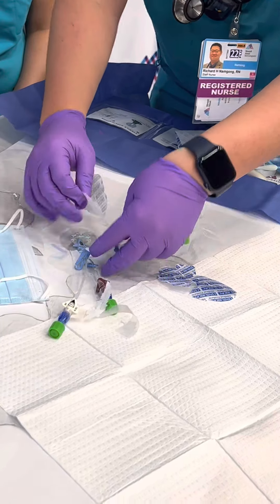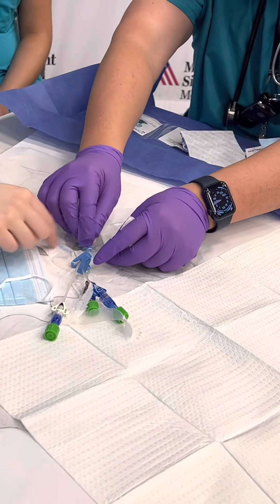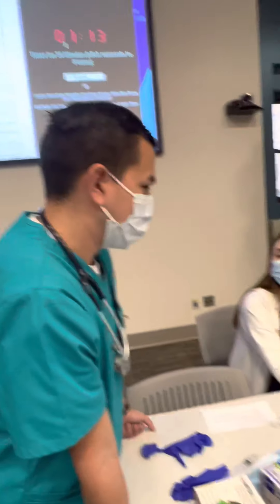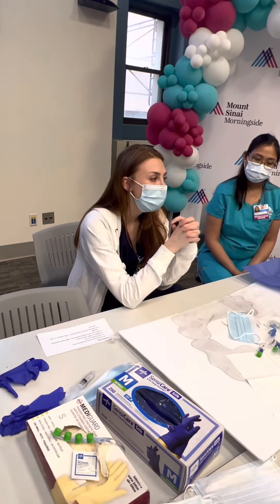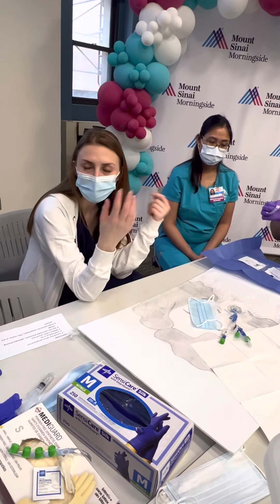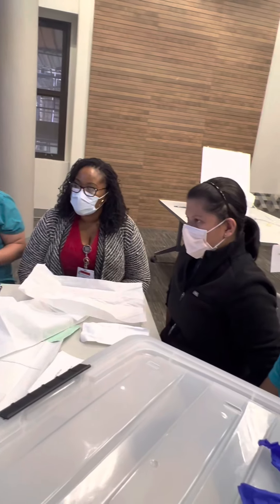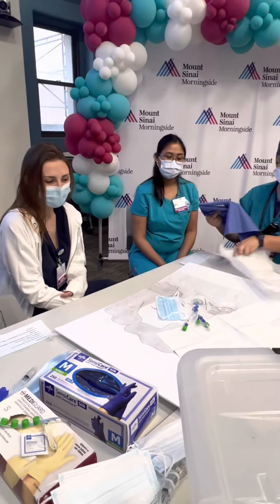What if there's a lot of bleeding from the site — at any point, if you assess your patient and there's blood, the biopatch is saturated in blood? Press and notify the provider right away, because that means the line may be out of position. The patient might have high coagulation numbers, so the doctor might want to come put a stat seal or surgicel around the site in place of the biopatch. If not, you would change the dressing because blood is still contaminating the dressing.